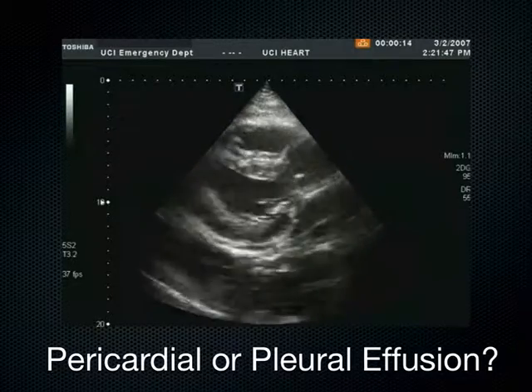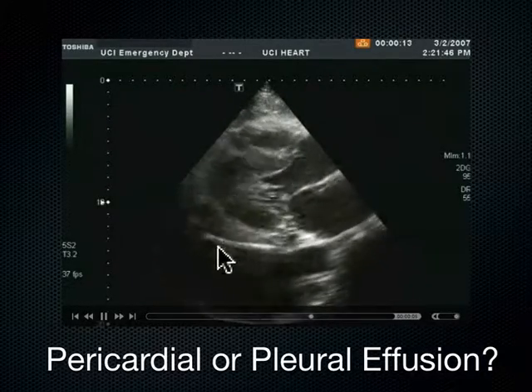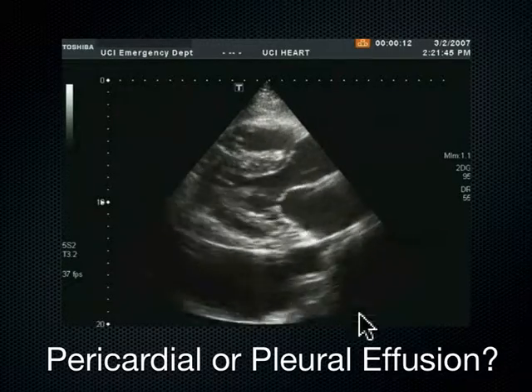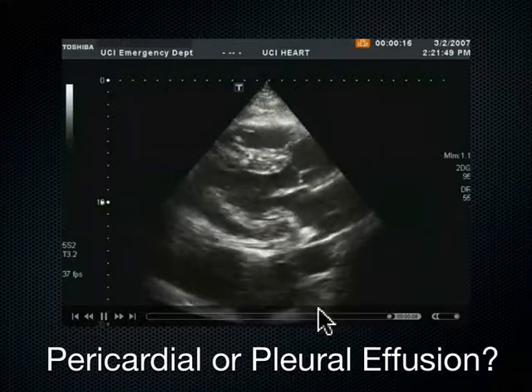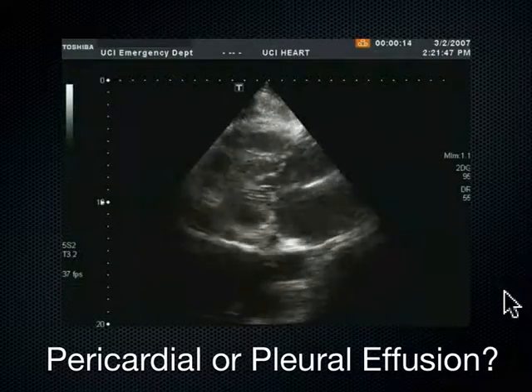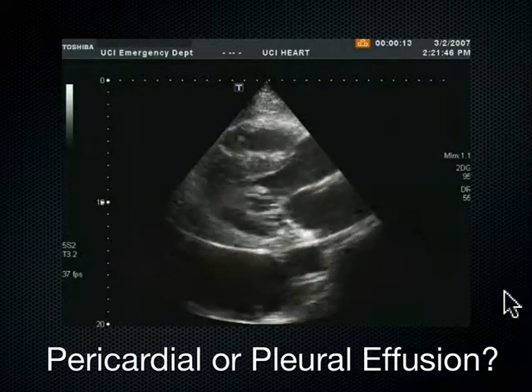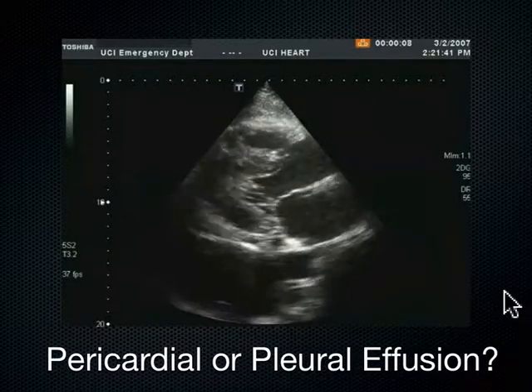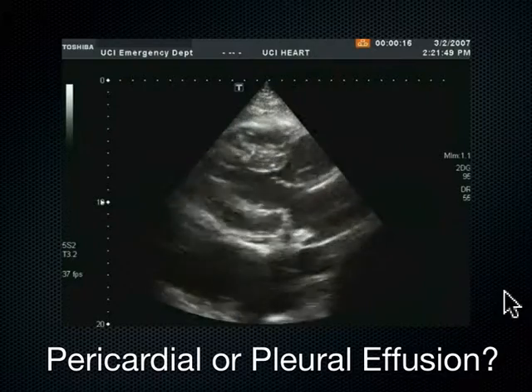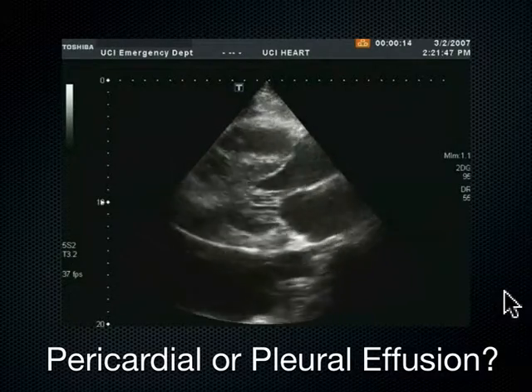Last slide: is this pericardial or pleural effusion? This is the parasternal long axis of the heart — RV, LV, LA. This fluid is posterior to the descending aorta — and therefore this is a pleural effusion. Confusing, I agree; it looks just like a pericardial effusion. But if it wasn't for that descending aorta — how do I normally diagnose a pleural effusion on the left? I go to my FAST exam window, looking at the spleen and the diaphragm. If I look superior to the diaphragm and don't see the mirror image artifact of the spleen in the chest, and I see all that black fluid on top of the diaphragm coronally with the phased array probe, that confirms it's pleural.